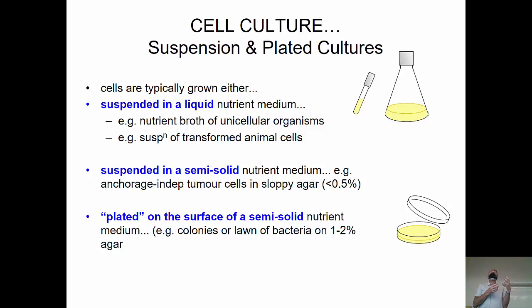The cells could be, say, suspended in a nutrient medium. So you have some semi-solid media, kind of like a barely set jello, I guess would be the best way to describe that. And the cells grow inside that. You may be familiar with using a more firm, or what we would call a semi-solid surface. And this would be things like the agar plates that we work with in microbiology, or if you're plating yeast cells, you'll plate them on a semi-solid agar surface.